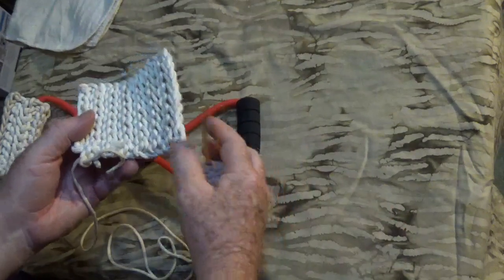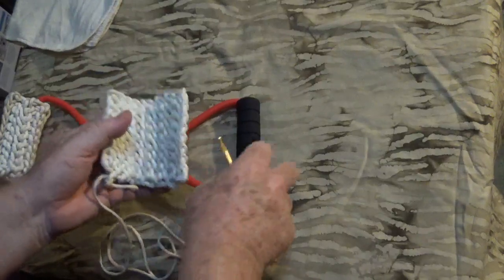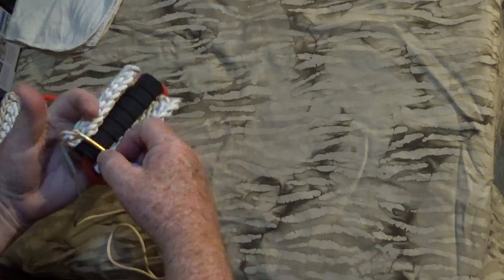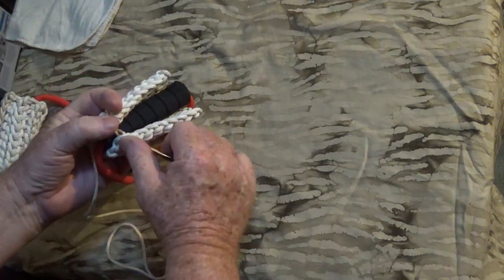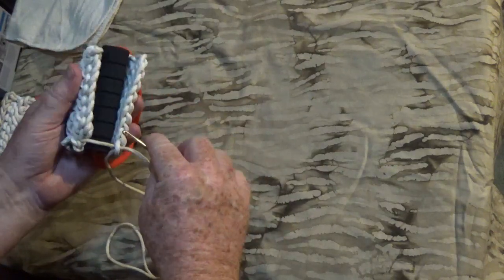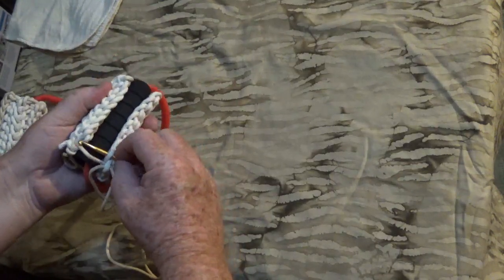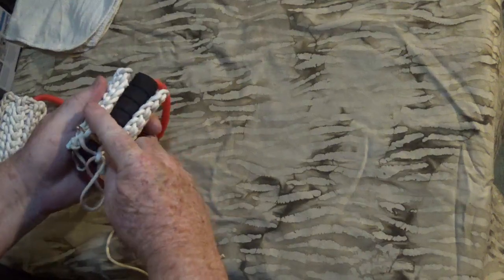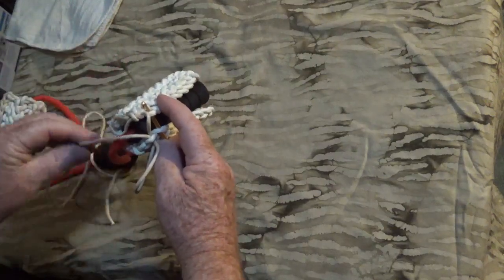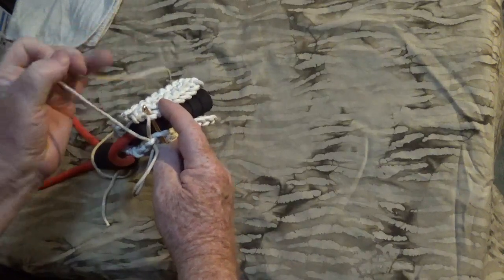and you bring the crochet hook and you line it up, and I found out this is the bottom. Crochet hook through, get it on first, bring the loop through, and make it a big loop to start with. Then with the next one to line up, we'll pull it through, go through a loop on the handle, and then this standing end, about 3 fingers worth, wrap it around so that the long end is on the top.